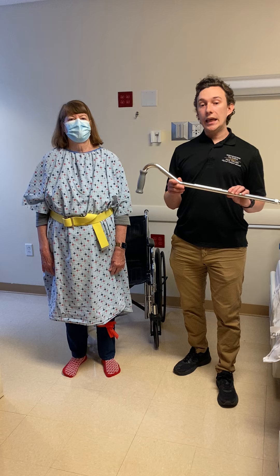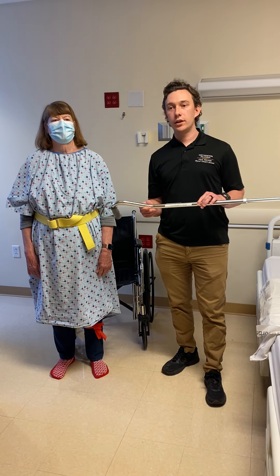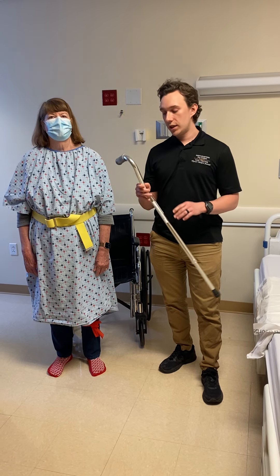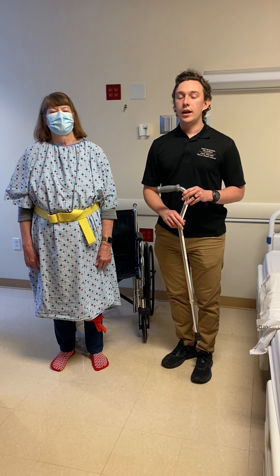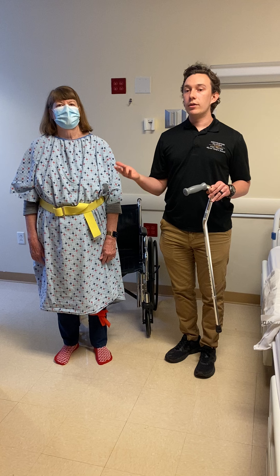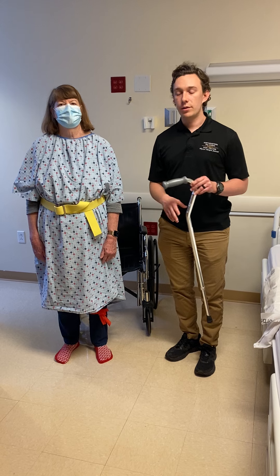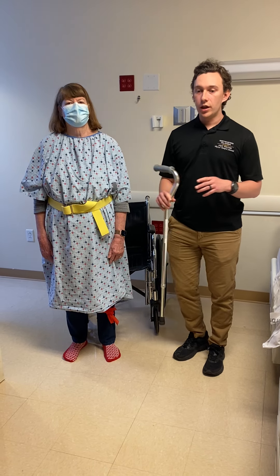When looking at a cane, you might be thinking: does it go on the bad side or the good side? The cane is going to go on the good side when walking with a patient. Here, her left leg is indicated as her bad side — you might reference that due to a certain pathology or orthopedic condition she might be having with her lower extremity. So this cane is going to go on her good side.